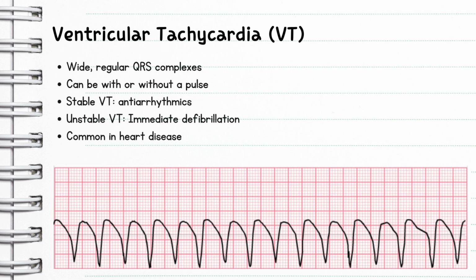Okay, some people will say these look like tombstones because it's basically telling you what's about to happen if you don't intervene, okay? It can present with or without a pulse. And that is very important for you to know, because that's going to determine what you do next, okay? If the patient is stable and has a pulse, they probably will not have a pulse for long, but if they have a pulse, you might be able to give meds to fix this, okay? You have just a smidgen of time, but you have a little bit of time.